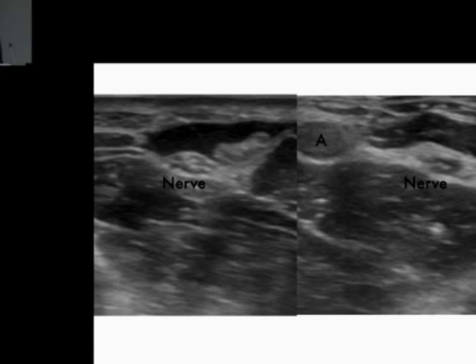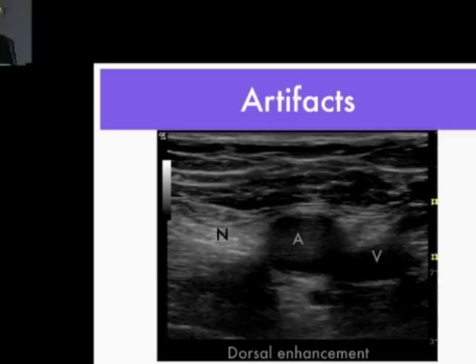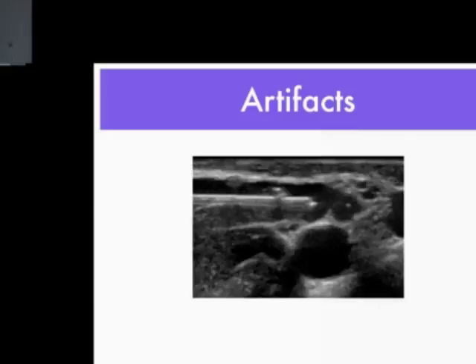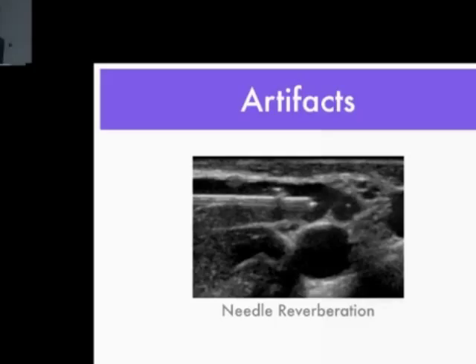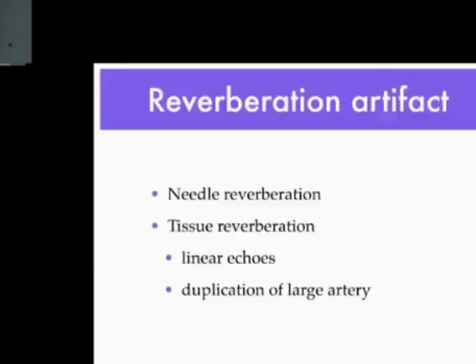Artifacts are another pitfall. There is often an artifact deep to a large artery called a dorsal enhancement artifact — do not get this mixed up with nerves, which are lateral to the artery. Another artifact is the needle reverberation artifact, which is actually a good artifact: it means the needle is in plane with the ultrasound beam, producing extra images of the needle deep to the real image due to ultrasound waves reflecting within the needle. There is also tissue reverberation comprising linear echoes and duplications of a large artery.